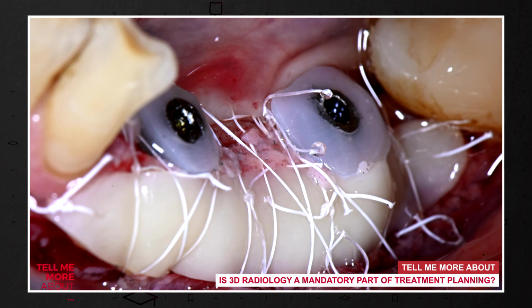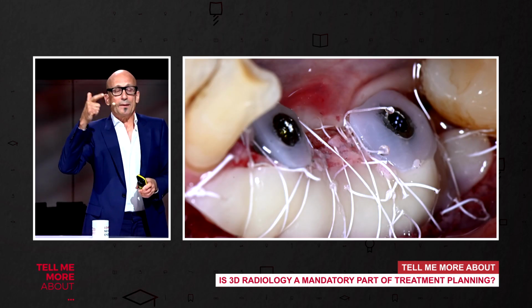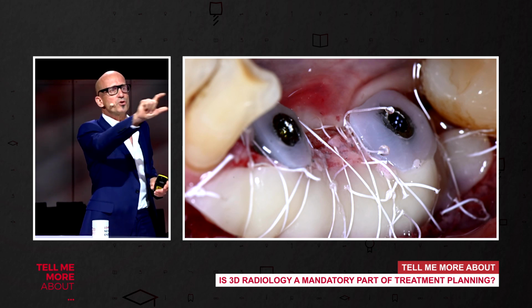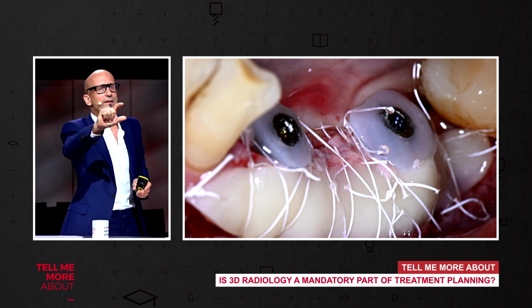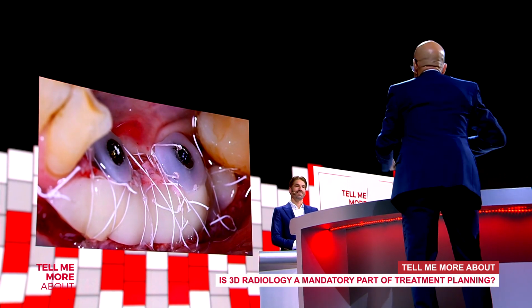So in the second session, the implants are placed, the impression is taken, and the soft tissue is managed. So at the same time, we manage the soft tissue. So now we place implant, we take the impression, and we manage the soft tissue. And we get a great result.